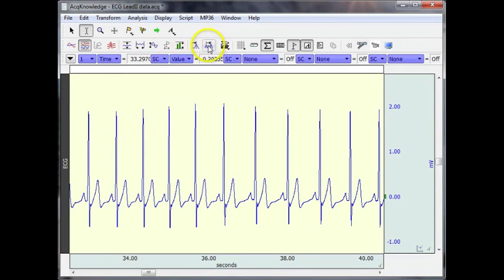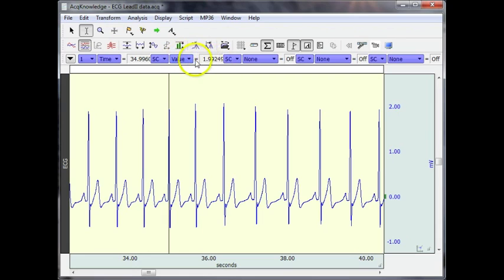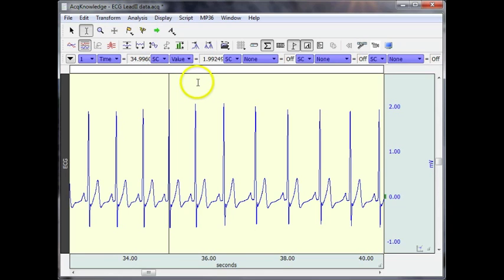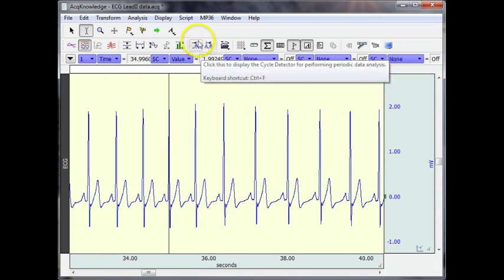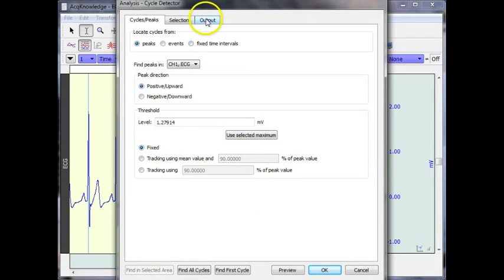I'm going to set the first one to time and the second one to value. What I want the software to do is go through my data, taking the value of the peak and giving me the time at which that measurement was taken.